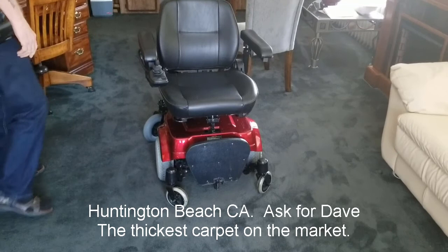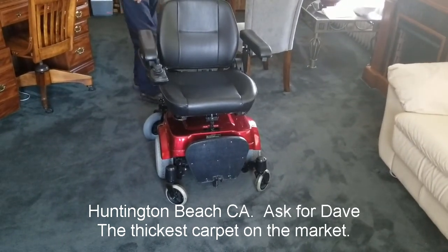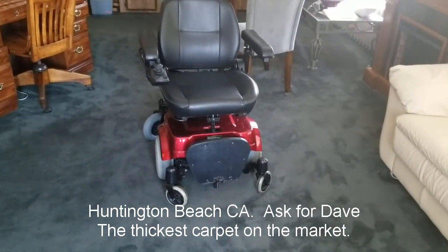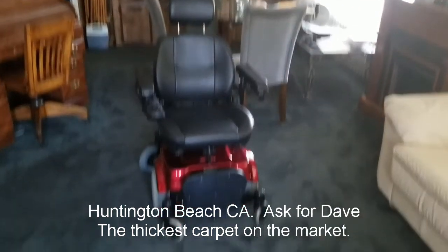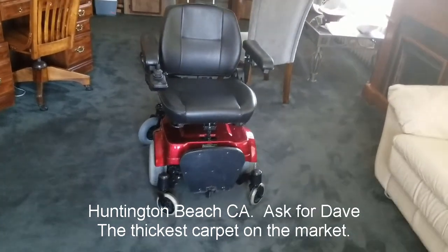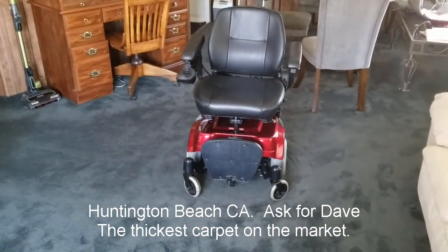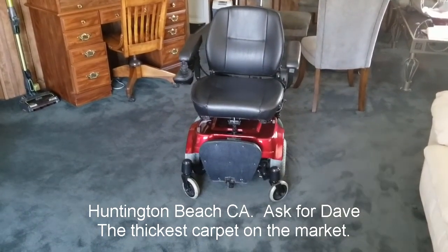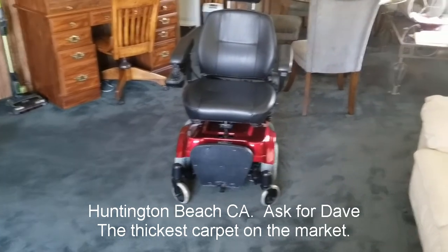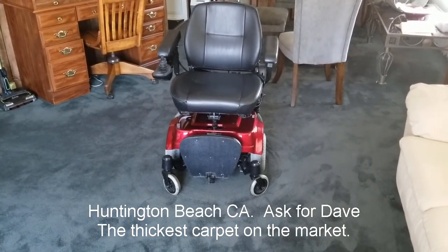If you're interested in purchasing this awesome electric chair, my phone number is 310-351-2961. My name is Dave — ask for Dave if you're interested in this electric wheelchair. Again, it's an in-house model, top speed of 3 miles an hour, top load capacity of around 500 pounds. And the model is HS2800 — it's about 10 years old.